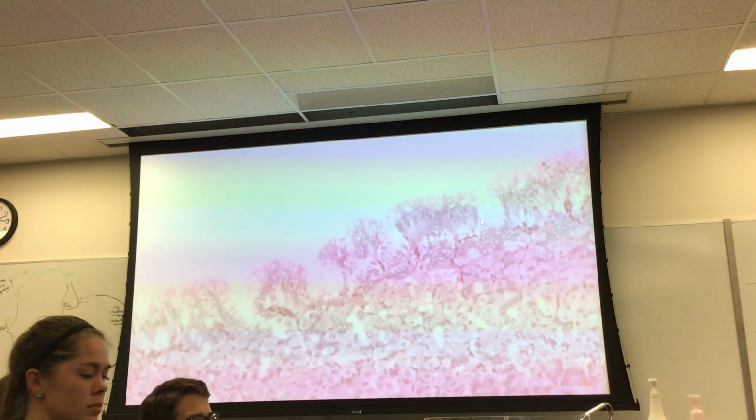I don't think I explained myself well. So let me start over with this. This is the stomach. That's the lumen. No. We're learning here. So this is the muscle. This is smooth muscle cut cross section. This is smooth muscle cut longitudinal section, but we're going below that. And I'm asking now, we're on the very outside of this organ.